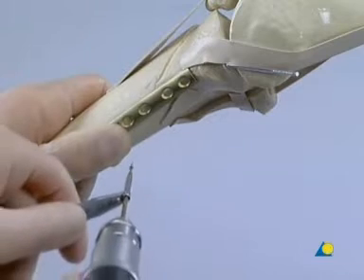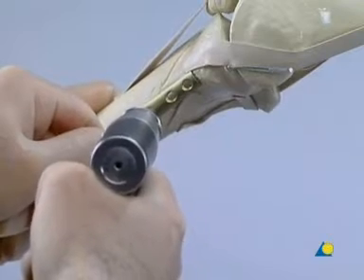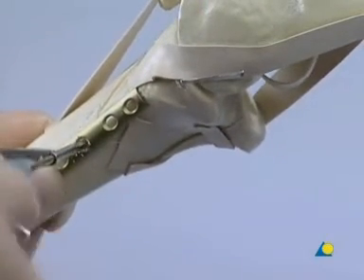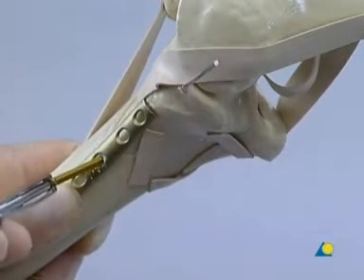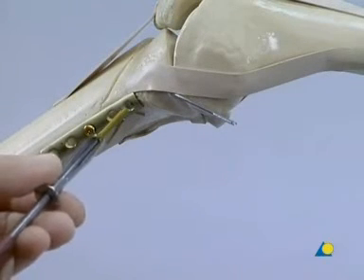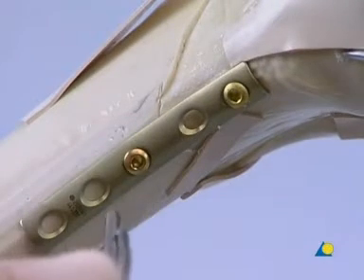Next, a 2.5 mm hole is drilled just distal to the apex of the fracture using the appropriate drill guide. A depth gauge is used to measure. A 3.5 mm tap and corresponding sleeve are used to cut the threads. A cortex screw is inserted through the middle hole of the plate — this maneuver pulls the plate into its anti-glide or buttress position, thereby reducing the fracture indirectly. Next, a cortex screw is introduced through the most proximal plate hole.